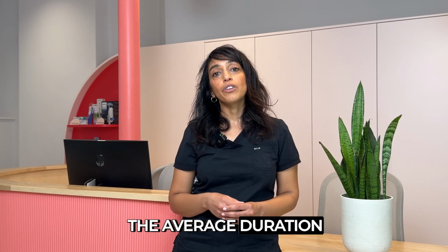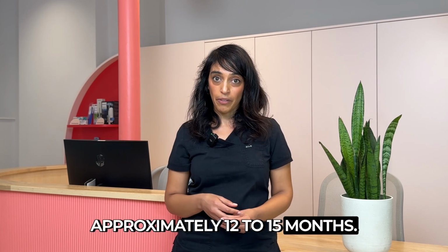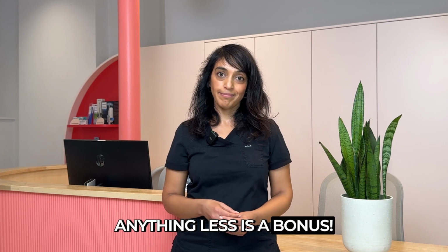The average duration of treatment with metal braces is approximately 12 to 15 months. Anything less is a bonus.